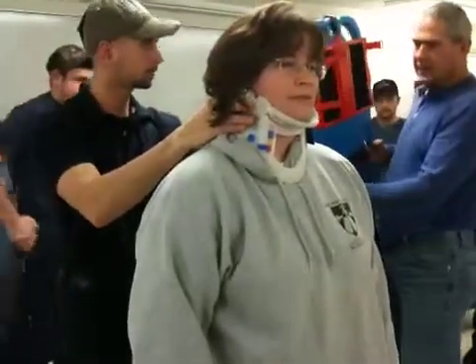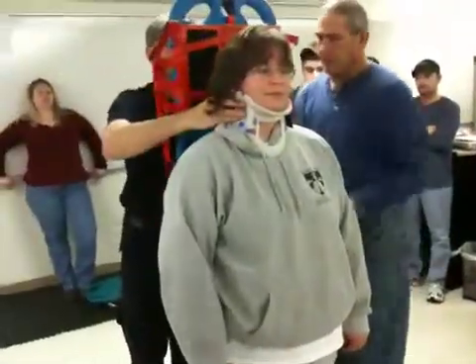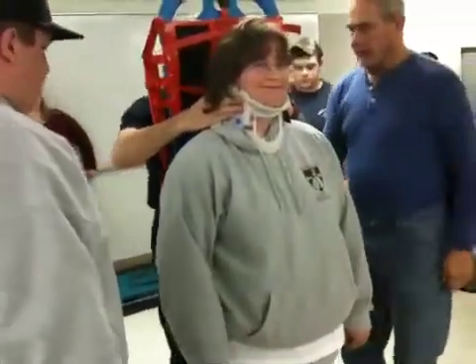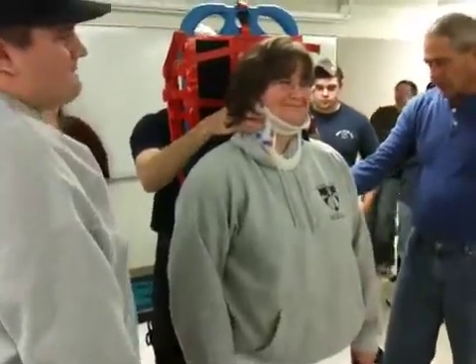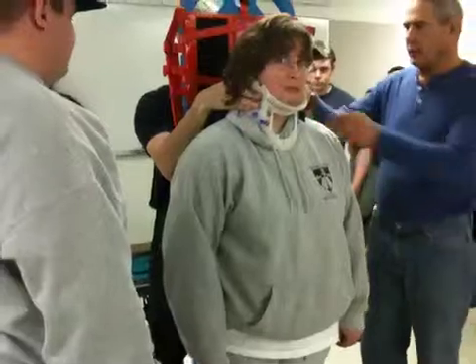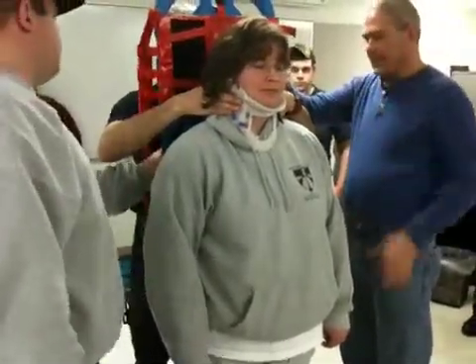Now, remember I told you it's a standing takedown. So you're fine with the board. All right. Now, you don't have to hold it with your foot. It's going to stand there. Your job is just to hold the neck. Don't strain. You're not going to have to do anything other than just hold the neck.